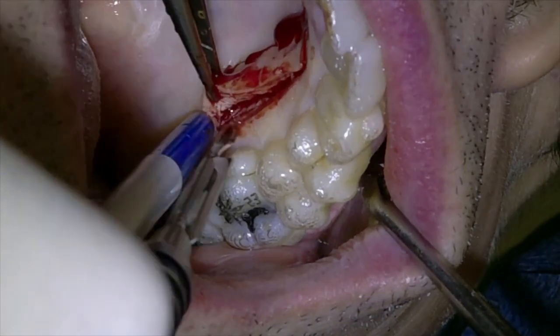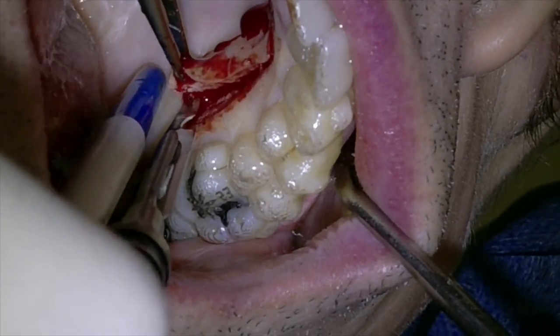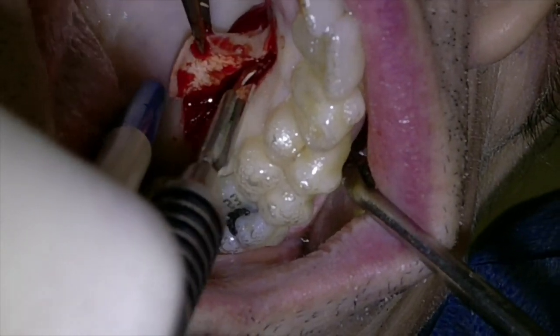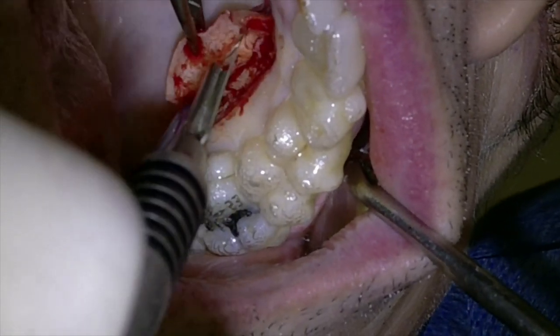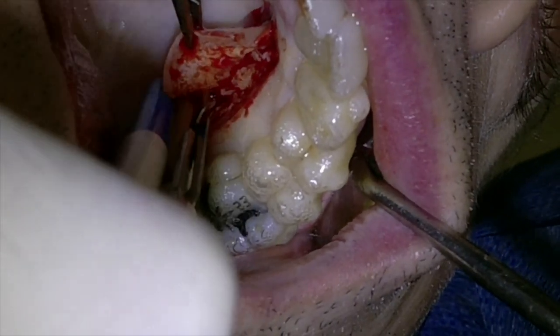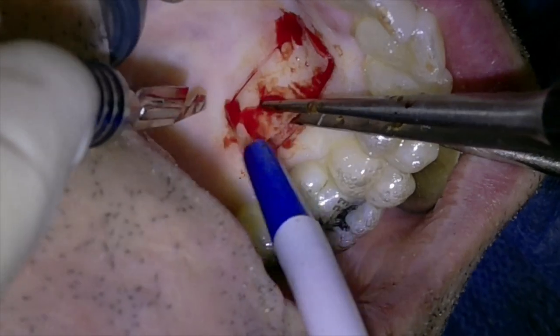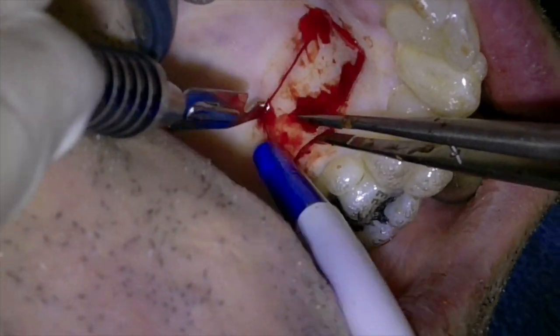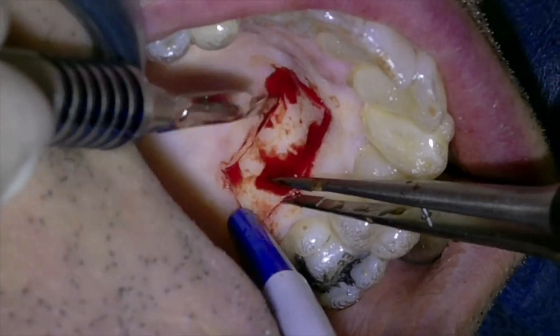So basically what I'm doing at this point, I'm just displacing very carefully that free gingival graft. I'm starting to detach from the most coronal aspect towards the apical aspect, and I'm leaving in place on the donor side a piece of connective tissue. All right, so you don't want to go full thickness, you're going to go split thickness.